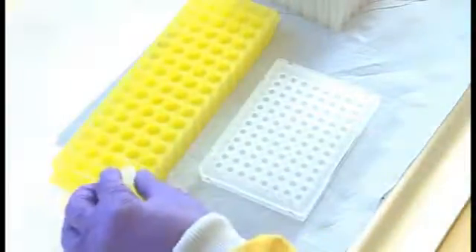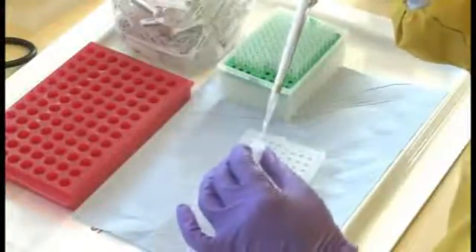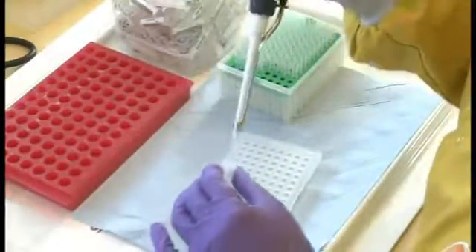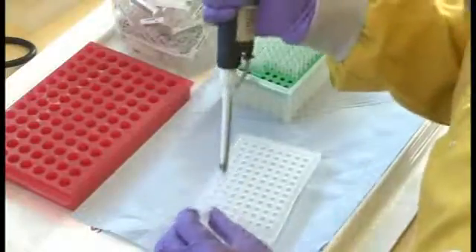The influenza virus is an RNA virus. We actually need DNA for the PCR to work. So we're now doing a special step that will change RNA into DNA so we can then complete the genetic testing. The test that we use, called the polymerase chain reaction, detects influenza genetic material.